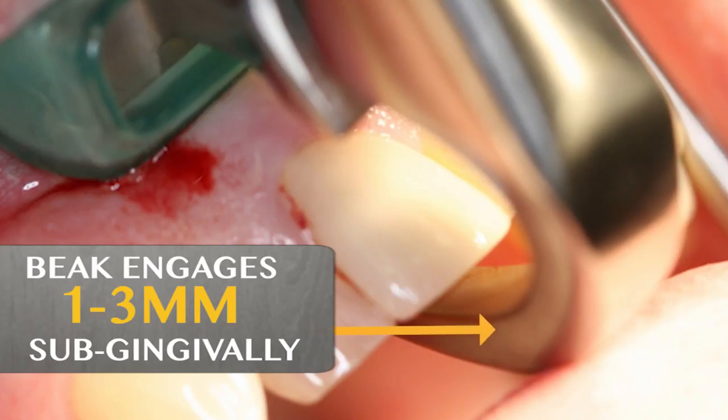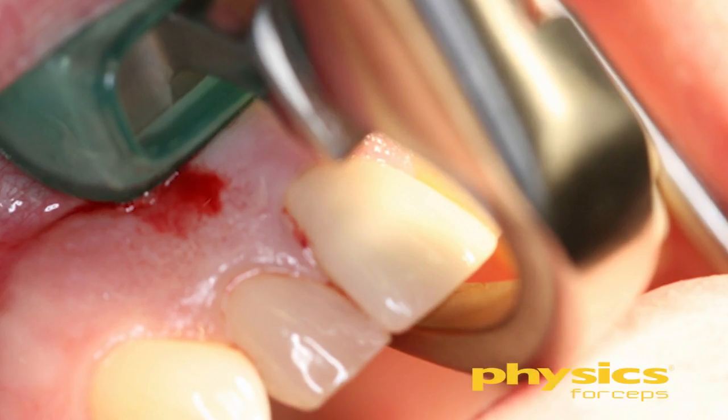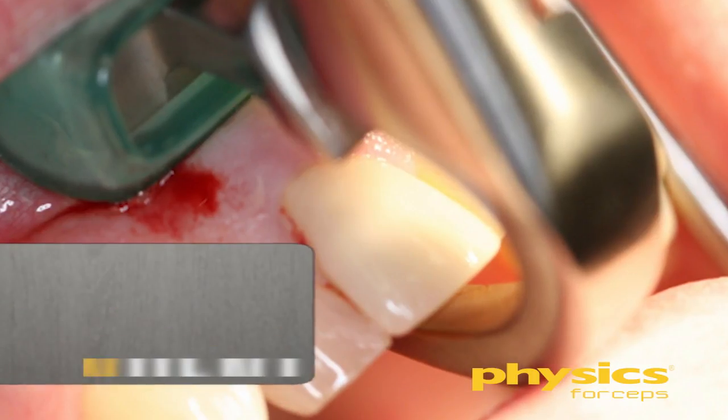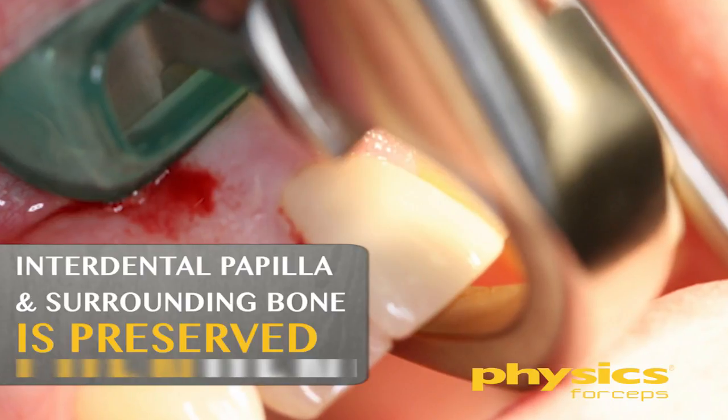We'll place the beak one to three millimeters subgingival. Since this is a crown, I don't want to engage the crown margin — I actually want to be onto the root structure. If you engage the crown, the crown may come out first, which isn't a problem, but we want to be efficient. We want to maintain the buccal plate, the facial plate of bone, the interdental papilla, and the interproximal bone — which is very important in the aesthetic zone.